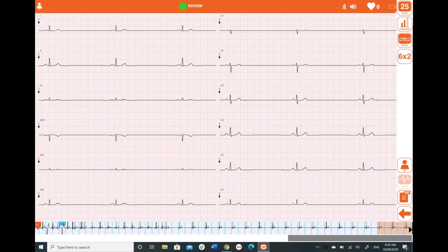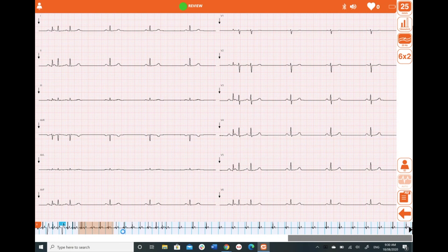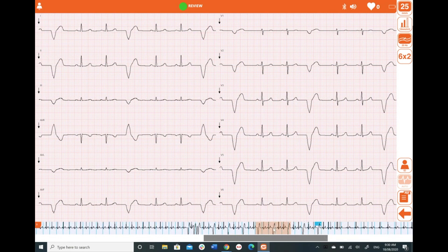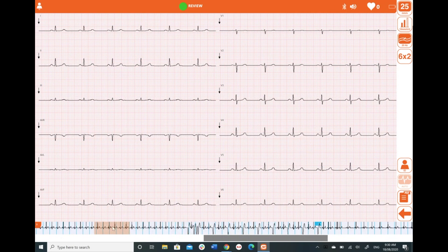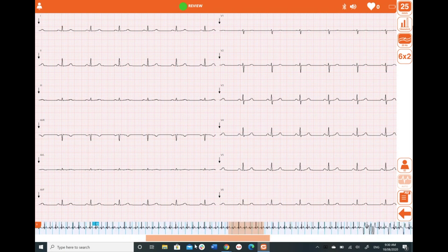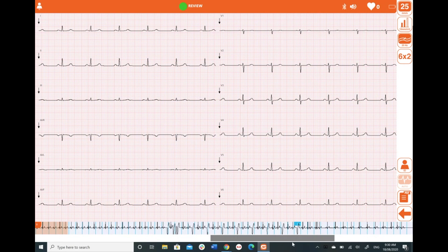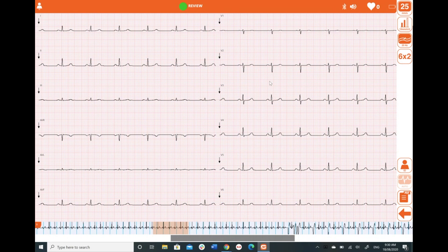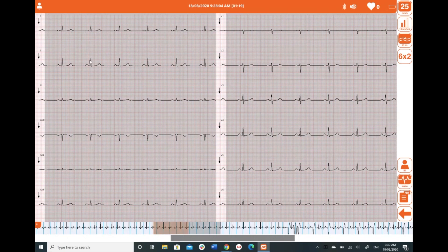If you're a mouse clicker like me, to get the orange window to move and view a section in the top screen, rather than left-clicking you want to right-click and scroll through to get what you want in the top panel. I want three ECGs for this patient: the normal sinus rhythm, some of the arrhythmia, and the slow heart rate at the back. I'm going to left-click on the left-hand side of the screen to highlight both panels in gray — that's the gray window that will appear in our report.